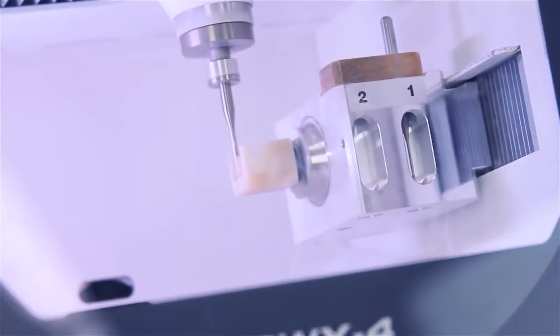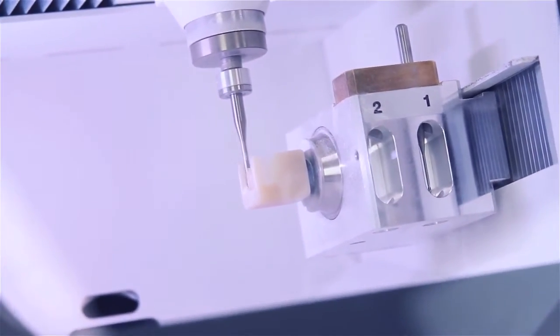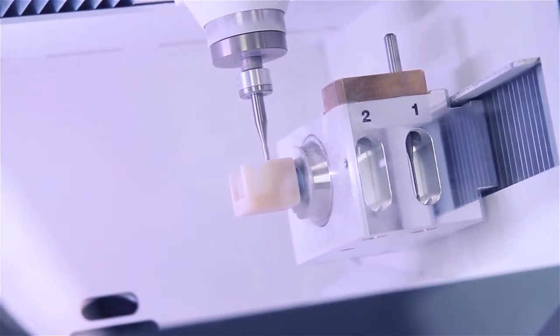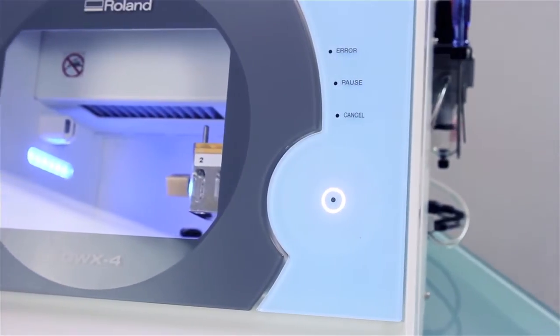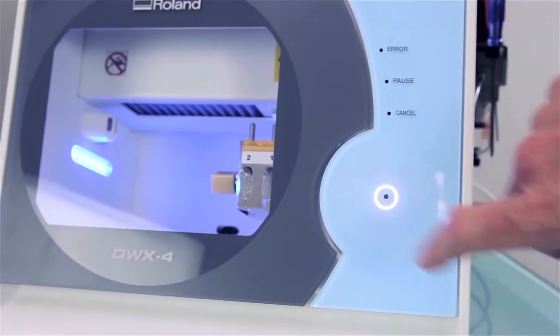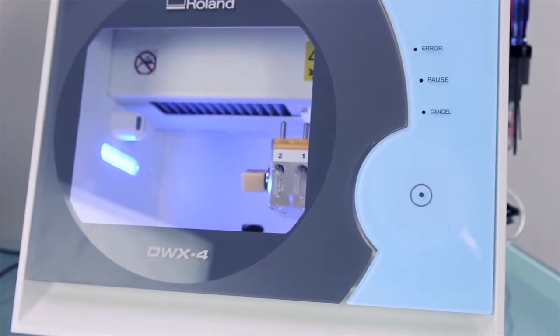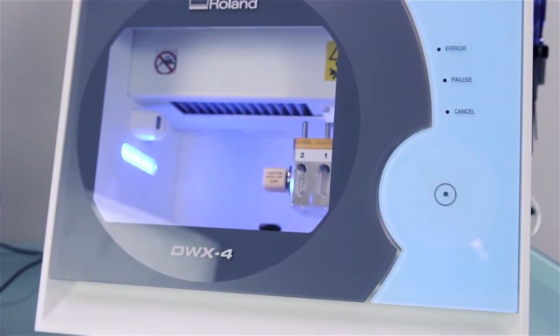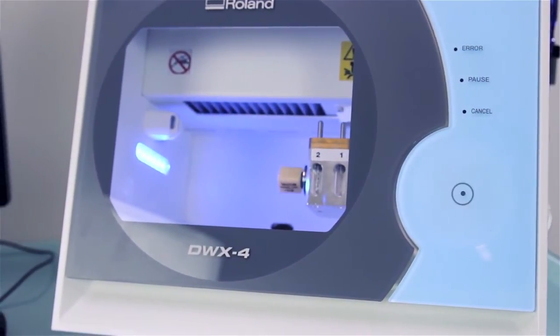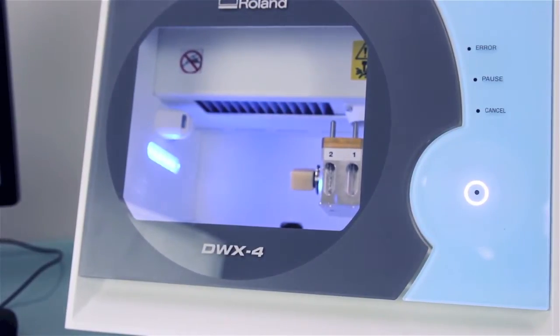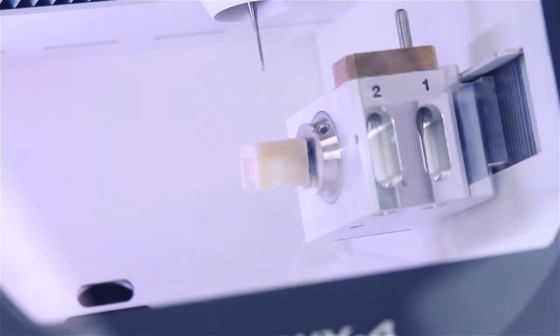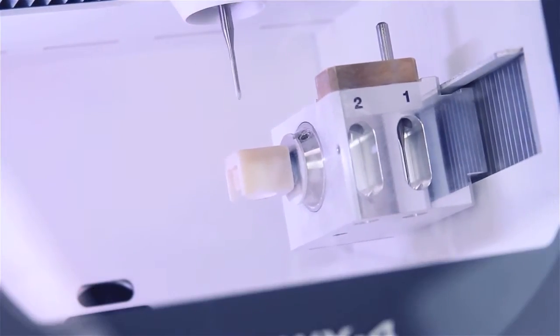It's so easy to use. After initializing the DWX4 by pushing a single button, just send your CAD/CAM file from your computer and watch it go to work. That's all it takes.